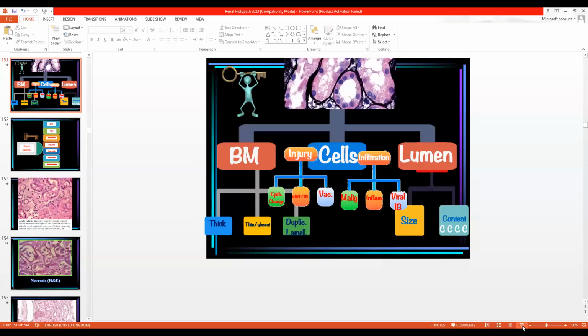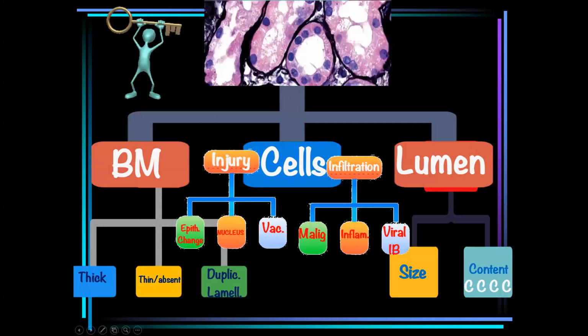We are now in the 10th meeting about renal nephropathology, but from a nephrology perspective. We are speaking now about the light microscopy part of renal pathology. We finished already before with all the glomerular changes that may appear under the light microscope. And in the last meeting, we discussed the slide in front of us.